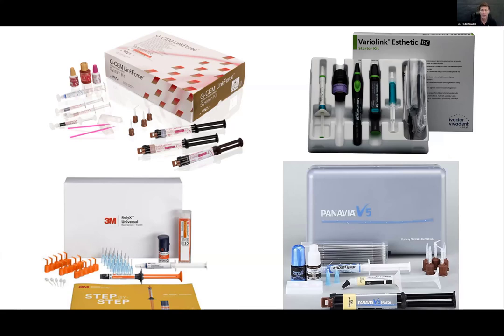Okay. Bisco is my favorite because I like the way it handles. I like the thought process in the systems. I like the research behind it. And so that's why I implement it. Okay. So again, for the most part, everything still applies to these, but that's why I said having one system to go through the whole process to keep it simplistic for you, so that you're not having to worry about chemistries. Each manufacturer has kind of figured out their own.